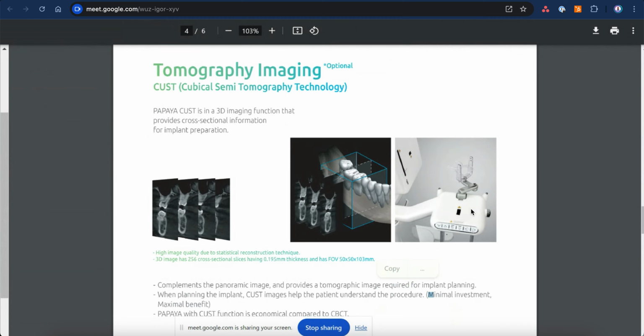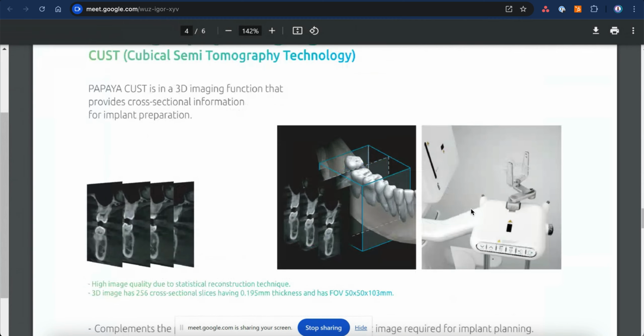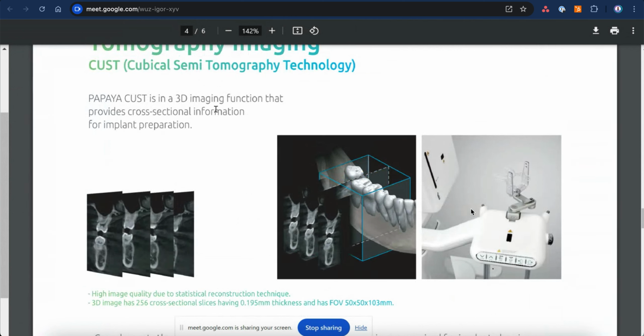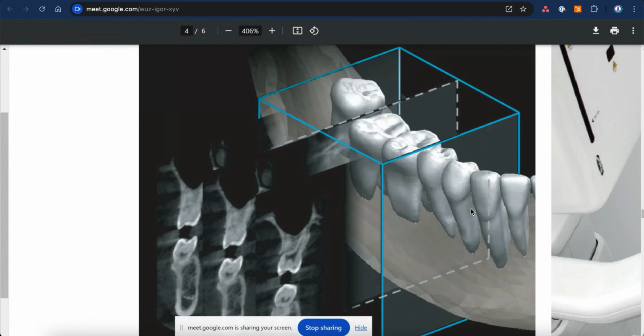Okay, this is tomography. What is tomography? Like I can do sections. This is exactly it. This is a 3D image that provides cross-section information for implant preparation. For example, here, this is the teeth. I can do the sections here, so this picture can appear.